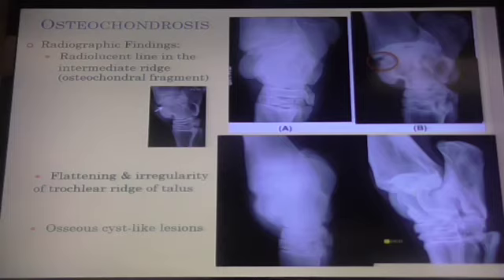If you don't say medial oblique, I'm just going to assume you're saying medial, which is a lateral view. If you just say medial, the beam went from medial to lateral. If you say lateral, it's the same thing as a lateral, because typically the beam goes from lateral to medial. Everybody got that?